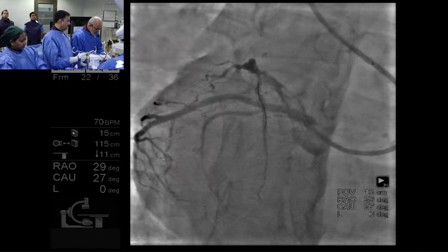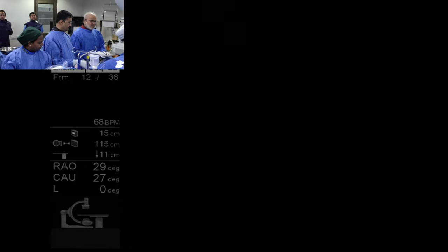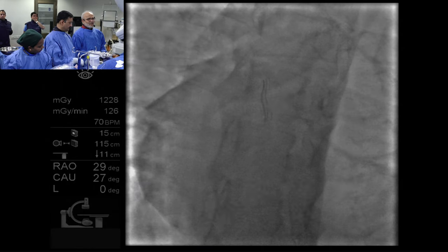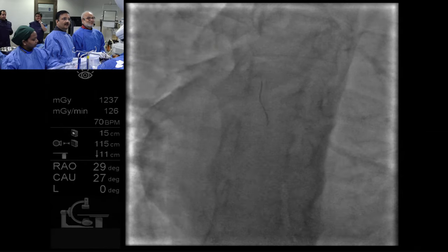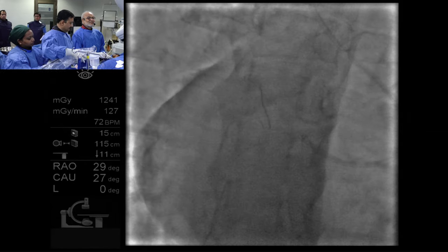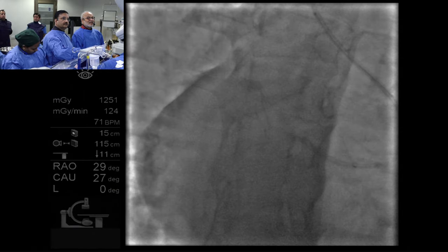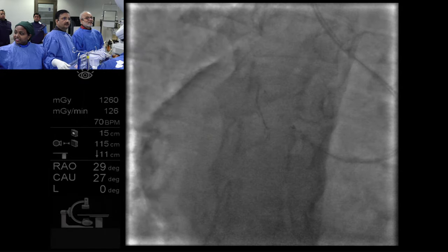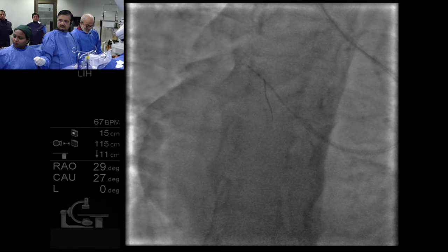Now, post IVL, can we still use Wolverine for the ostium? That all depends. My question to you is, post stent, have you used it? No, I haven't used it post stent because it may disrupt the drug delivery system. Cutting balloon, I have not used. IVL or cutting balloon? I am asking about cutting balloon. Post stenting, no, I have never used.